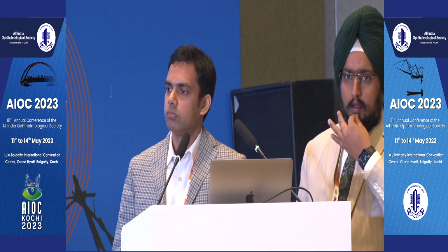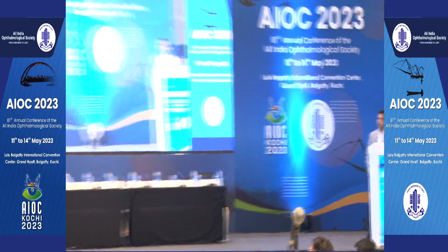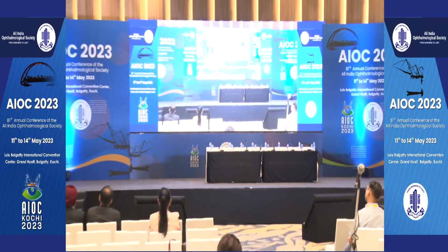There'll be a caving in of the walls of the eye, and that tells you that either your infusion's too low, or it's kinked, or the cannula is partly blocked, or it wasn't checked before inserting, or your vacuum is just through the roof. So there's an infusion outflow mismatch, because there'll be a global issue going on.